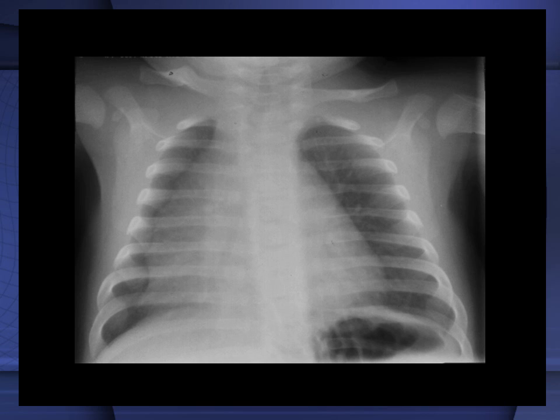So what I'm outlining now is the cardiac silhouette. And then here on the right side and overlapping with part of the cardiac silhouette is the thymus gland. So it's important that we understand that the mediastinal silhouette in a young child is overshadowed by the shadow of the thymus so that no misinterpretation can be made regarding the cardiogenic status of the adolescent or child patient.